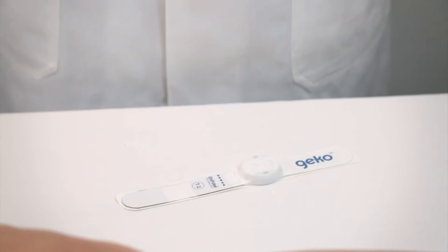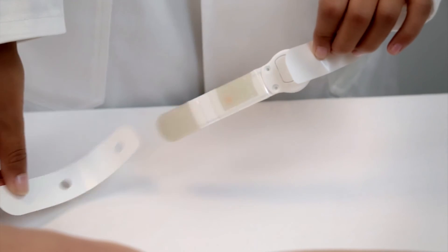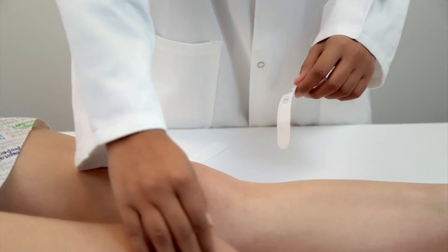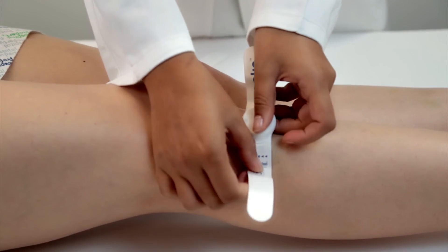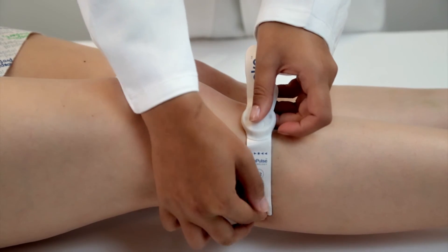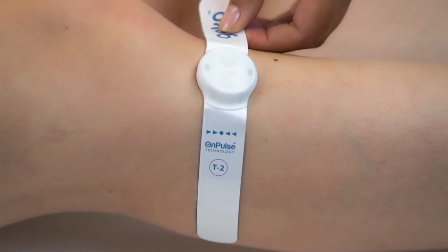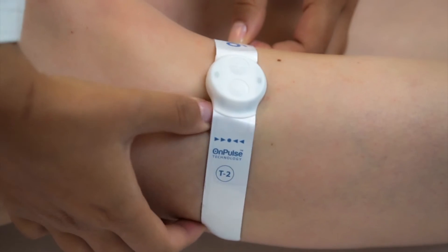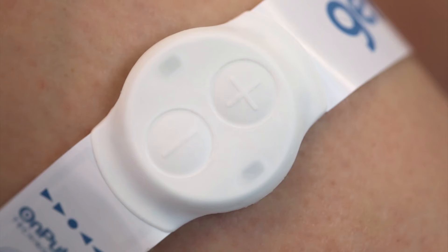After 30 seconds, allowing the skin to dry completely with the device switched off, peel off the protective film from the long end first. Secure the device to the leg so that the location marker — the line of arrows — is positioned directly over the centre of the fibular head. Next, remove the protective film from the short end and secure this to the front of the leg. Correctly fitted, the longer tail should wrap around to the rear of the leg, below and parallel to the crease of the knee. This will place the negative electrode over the common peroneal nerve and will position the plus button at the front of the leg and the minus button to the rear.